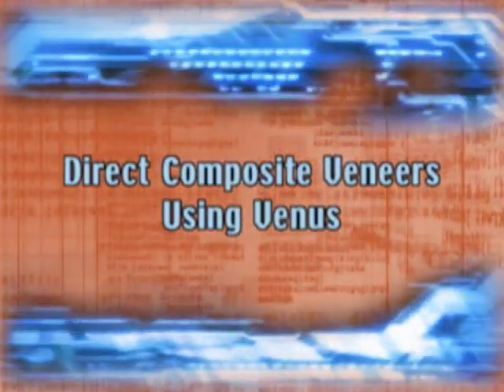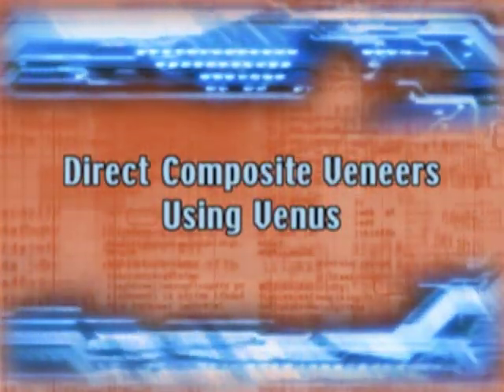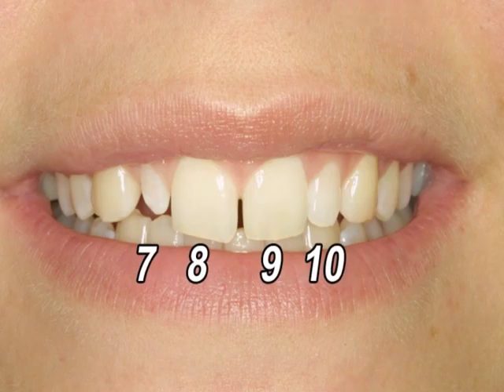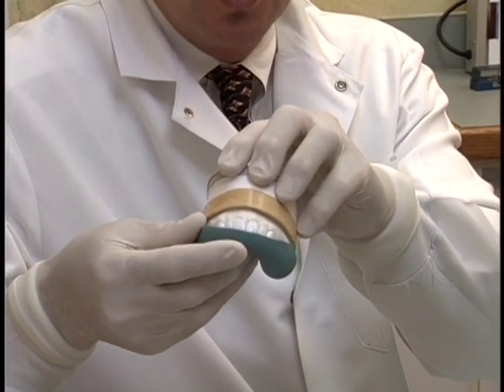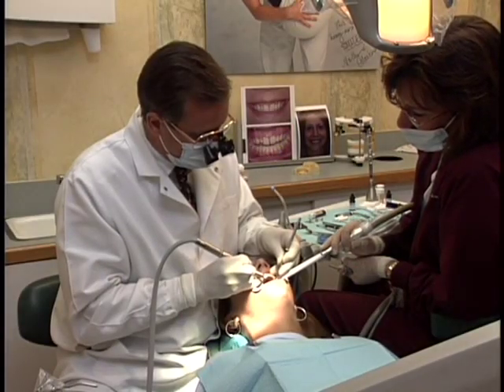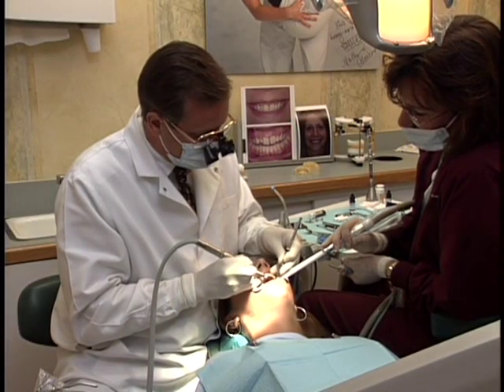Procedure number 1. Direct composite veneers using Venus. In our direct composite veneers case, to be done on teeth 7, 8, 9, and 10, please note we will be using a silicone index made from the final wax-up. We will also be layering the composite in order to match both body and enamel shades.